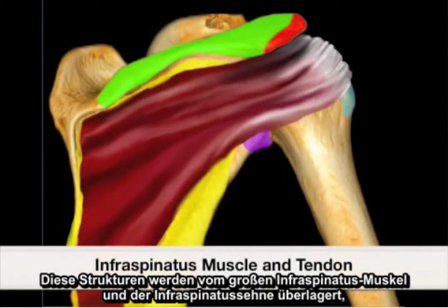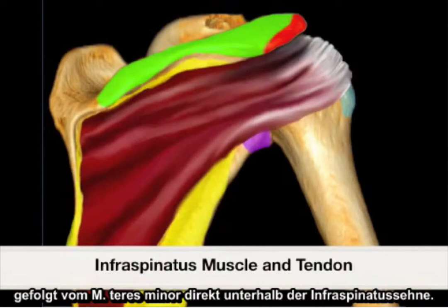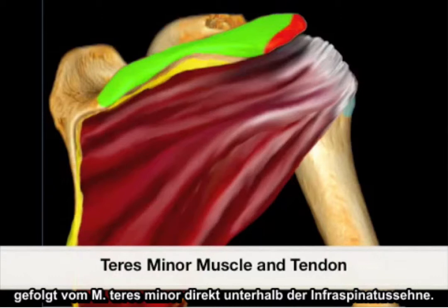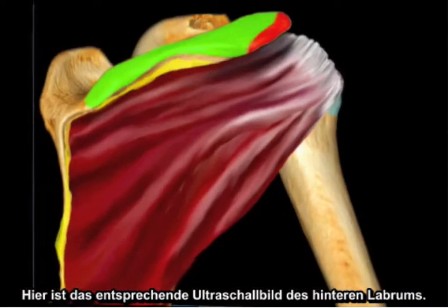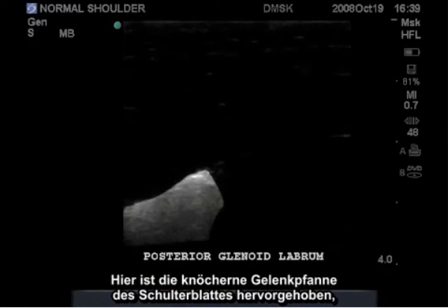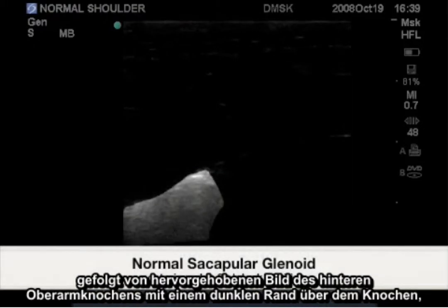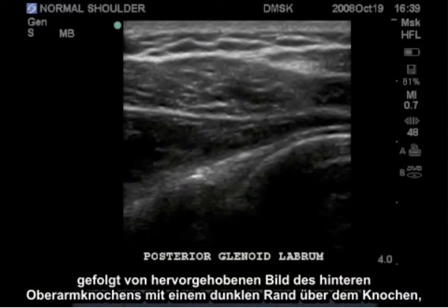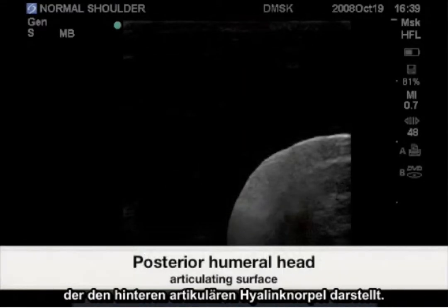Overlying these structures is the large infraspinatus muscle and tendon, followed by the teres minor, resting just inferior to the infraspinatus tendon. In the corresponding ultrasound image of the posterior glenoid labrum, we have highlighted the bony glenoid of the scapula, followed by a highlighted image of the bony posterior humerus with a dark rim over the bone representing the posterior articular hyaline cartilage.